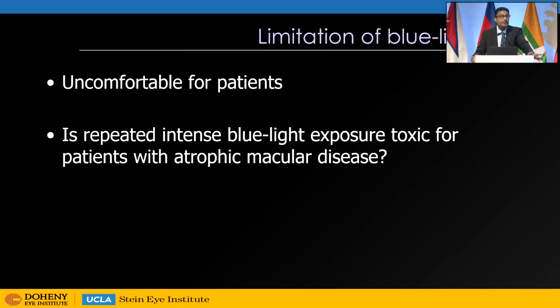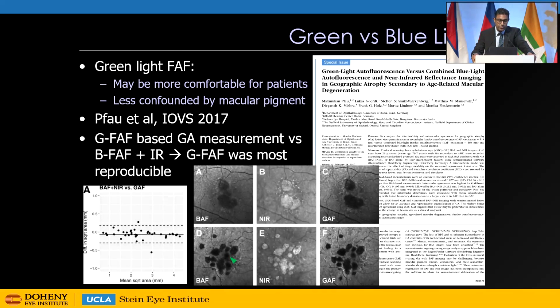It can be quite uncomfortable for those of you who've been imaged with this technique. And some have questioned, even though we have ANSI standards for this technology, whether in the setting of retinal disease those patients may be more susceptible to repeated blue light exposure. Fortunately, many devices now offer the option of green light autofluorescence, and this nice paper from Frank Holz's group highlighted how they can achieve similar measurements as you obtain with blue light autofluorescence.